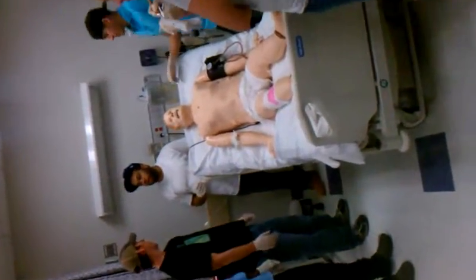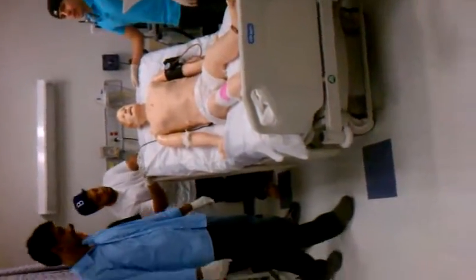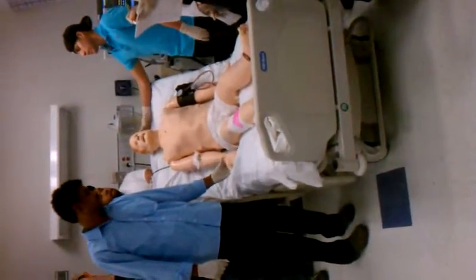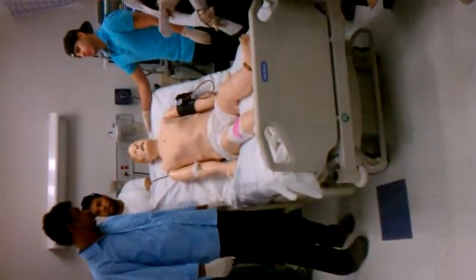And why would you do that instead of doing a Venturi mask? It's just on him because he's been intubated for several days, and it's for the swelling and the soothing effect from the tube that they'll put a cool mist on him. Do we do that much out there today? Absolutely not. That's why we do a leak test, right? Yeah, that's why you do a leak test now.